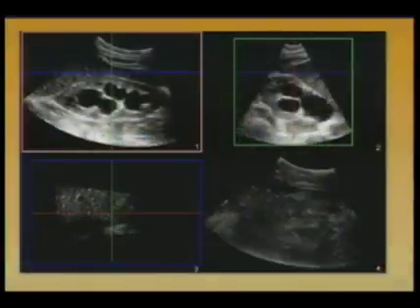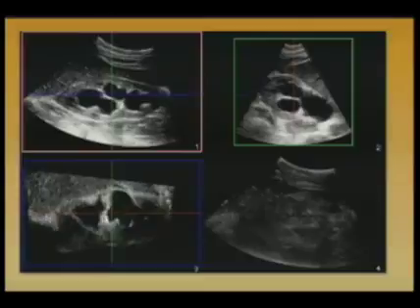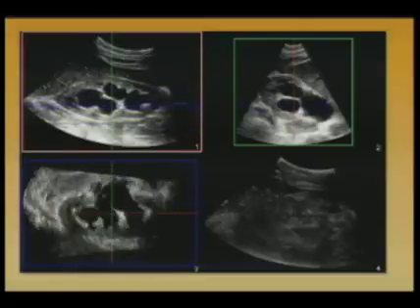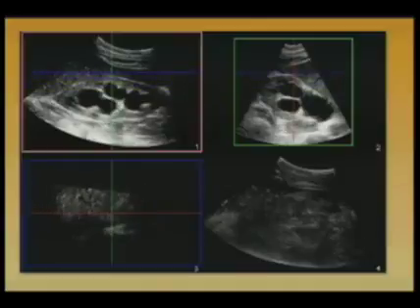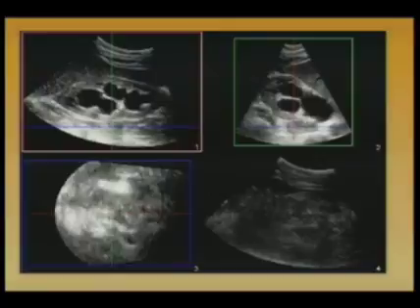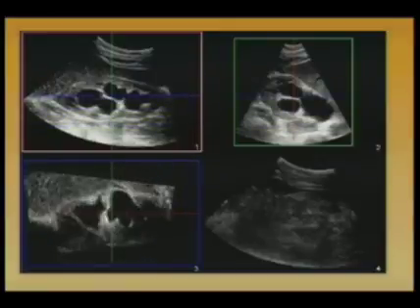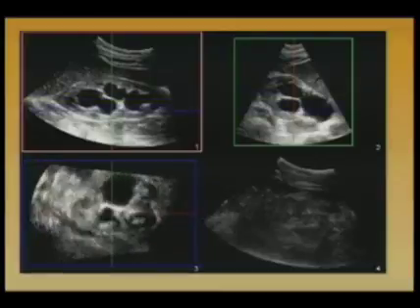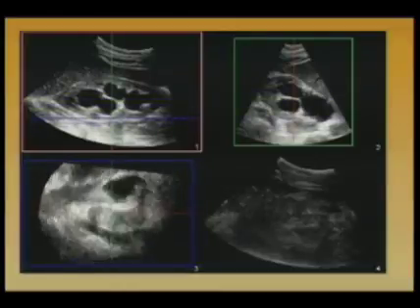The renal collecting system, when it's distended with urine, also lends itself to 3D imaging. Here, as you watch the reconstructed C-plane in the bottom, you can see a nice coronal view of the kidney, a true coronal view showing the dilated collecting system, the dilated pelvis, and a bit of the tortuous dilated ureter in this patient with hydronephrosis secondary to ureteral obstruction from cervical cancer.